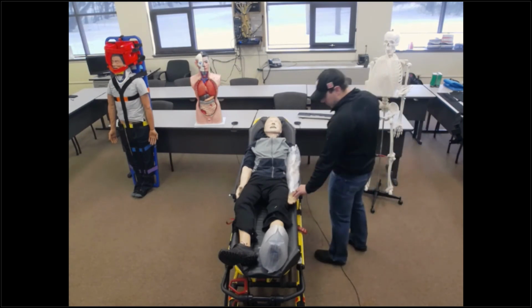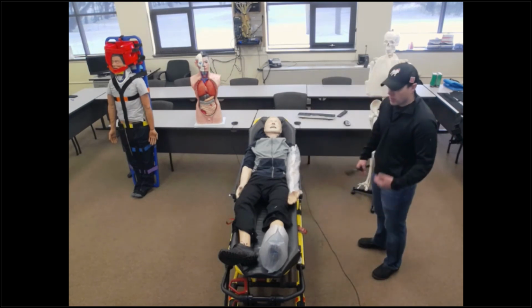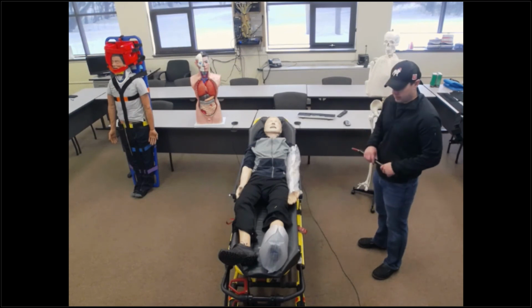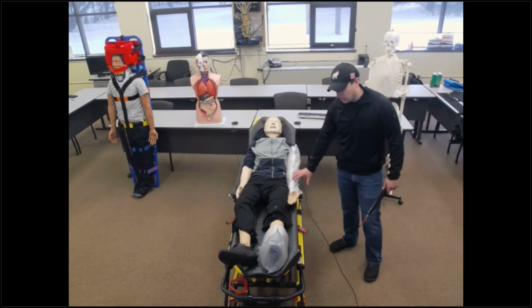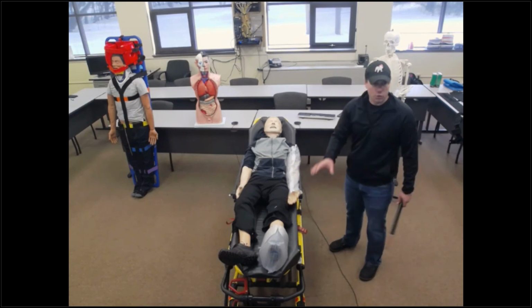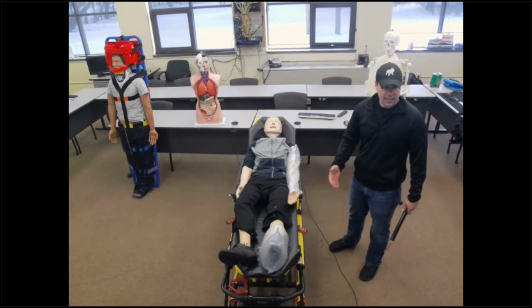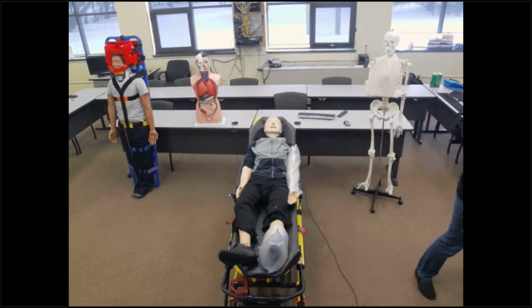Recheck CMS. Can you feel me touching you? Go ahead and wiggle your fingers. And then go ahead and do your pain assessment as well. So we identified that patients experienced an 8 out of 10 pain on the ankle, 8 out of 10 pain on the arm. After we've applied those splints, go ahead and reassess their pain value. Has your pain changed at all? That does it for air splints.